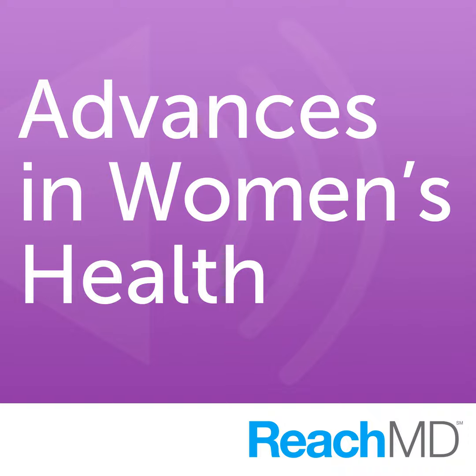Robotic-assisted surgery is, in my opinion, the next generation of technology in minimally invasive surgery. What the system actually has is a surgical system, and it has three components associated with it, whereas standard laparoscopy has pretty much a laparoscope and some surgical instruments. This has a dedicated vision system, a dedicated surgeon's console, as well as a dedicated patient-side cart. The three components work in conjunction with each other to perform more difficult and more complex minimally invasive surgical procedures, such as procedures for gynecologic malignancies such as cervical cancer, endometrial cancer, and certainly complex benign gynecologic procedures.